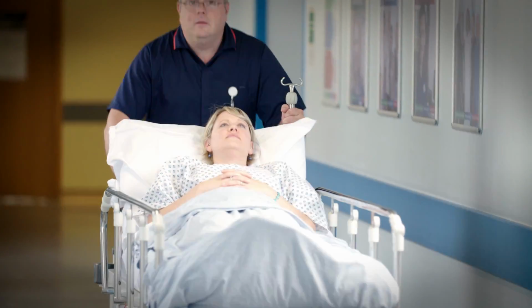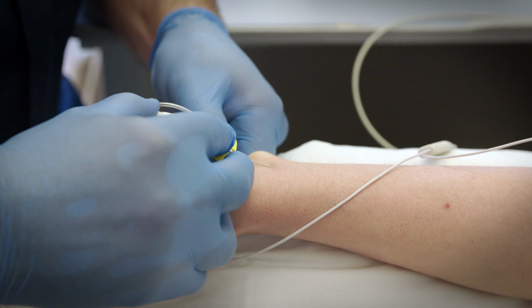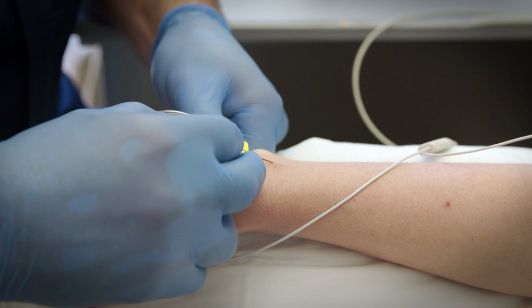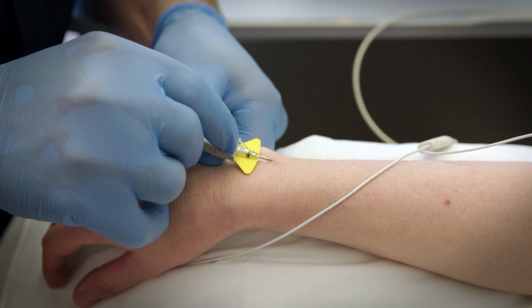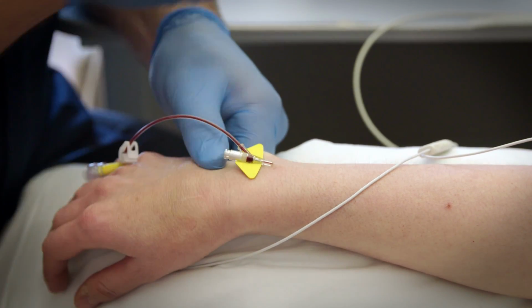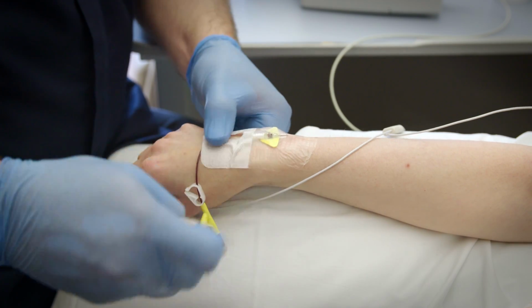Quick access to viable veins is crucial for patients who are in shock, suffering from decreased blood pressure and in need of IV fluids. When fewer attempts are required, potential side effects like hematomas and vasovagal episodes can also be reduced. The risk of infection lowers too. Veins that are easier to access also increase satisfaction rates and the quality of life for patients. The fewer attempts, the lower the likelihood that additional procedures to gain venous access will be needed.